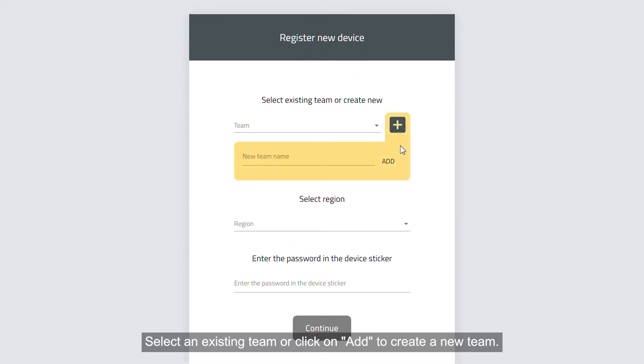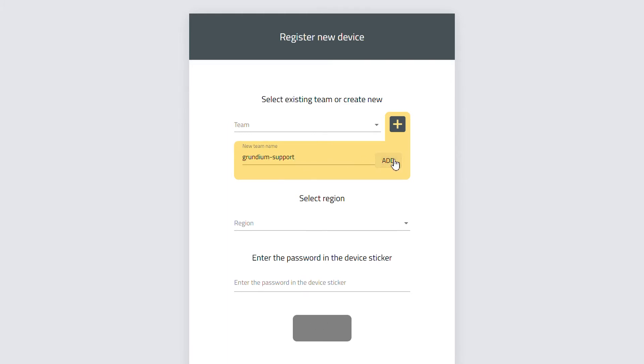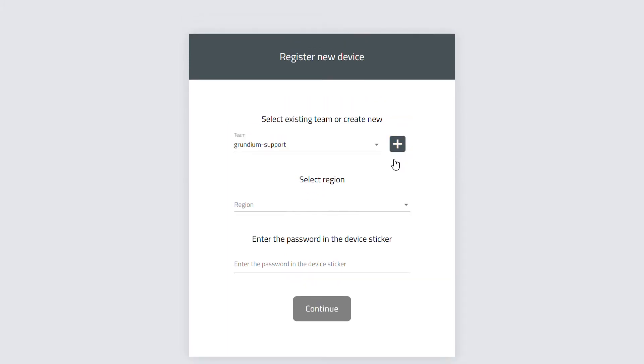Select an existing team or click on Add to create a new team. Select your region.